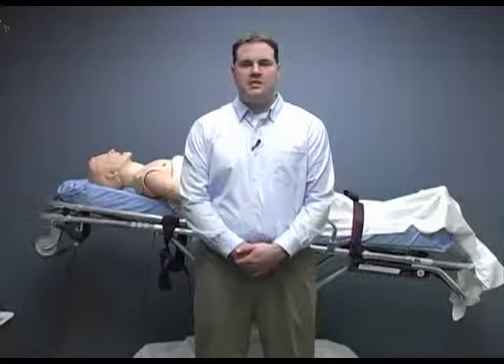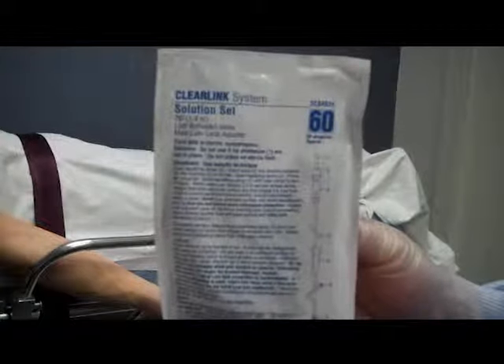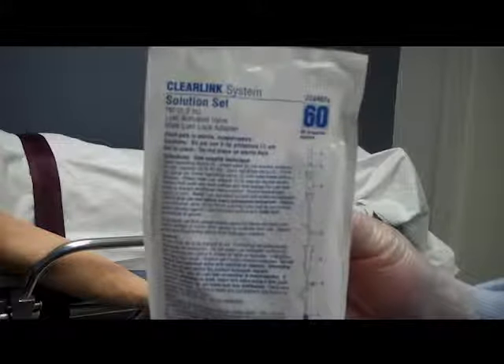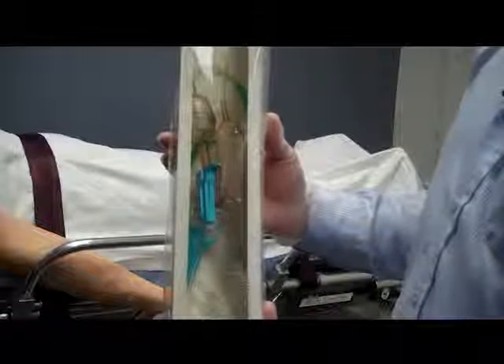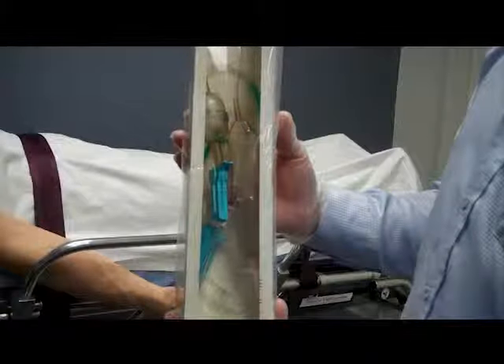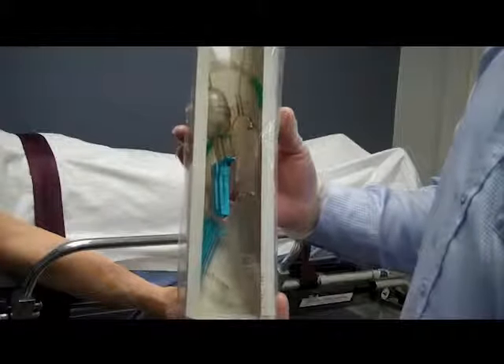I will check the IV administration set next. We need to ensure the correct drip set has been selected. A micro drip is rated at 60 drips per milliliter and is generally used for medicated infusions or in situations where you have to be very precise about how much fluid is given to the patient. A blood administration set allows for the infusion of blood products and is generally rated at 10 to 15 drips per milliliter. In some blood administration sets there is a pump that allows you to move fluid quickly into a patient.